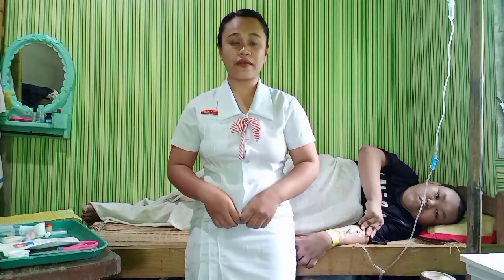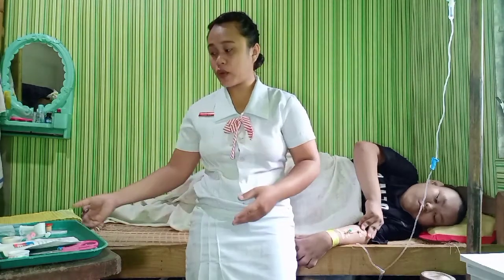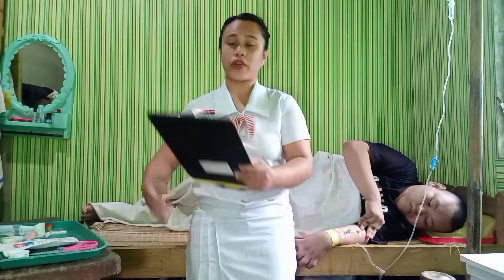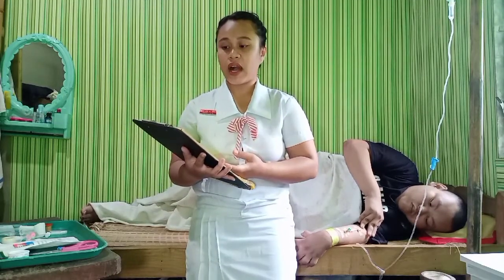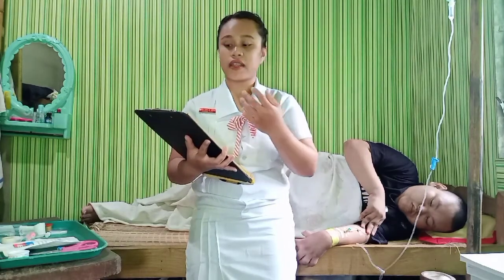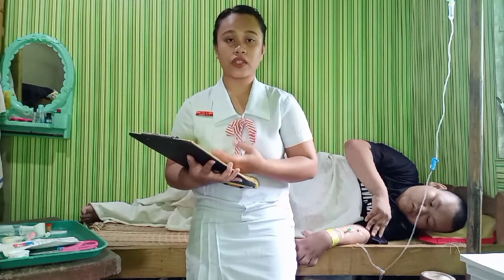So hi, I am here now again to perform a procedure of discontinuing IV medication or IV therapy to the patient. So first things first is to review or check the physician's order to confirm that the doctor has ordered discontinuing the IV medication.